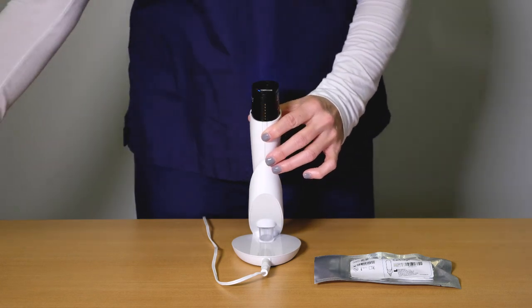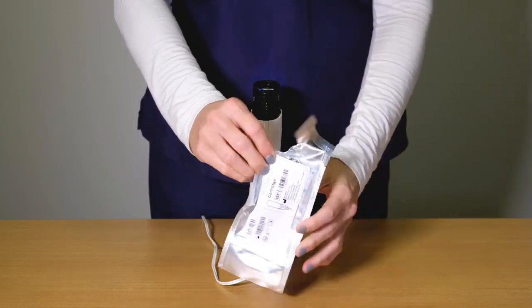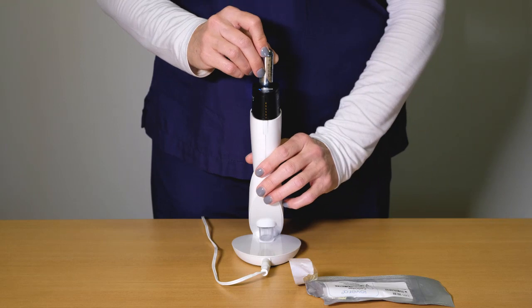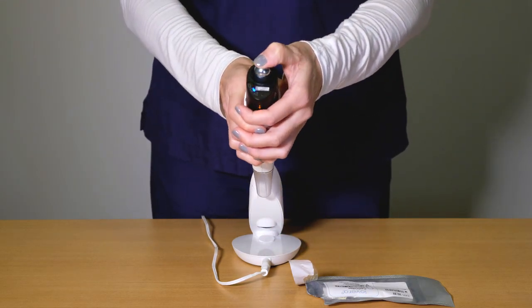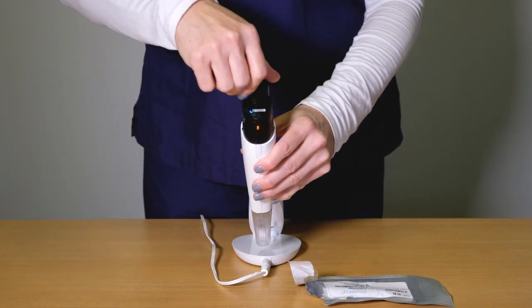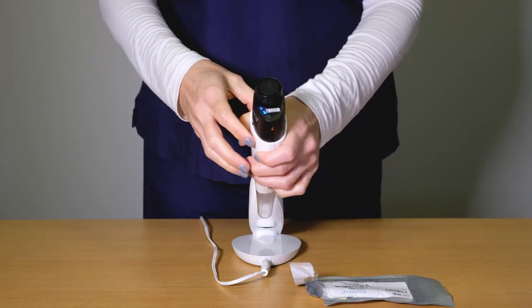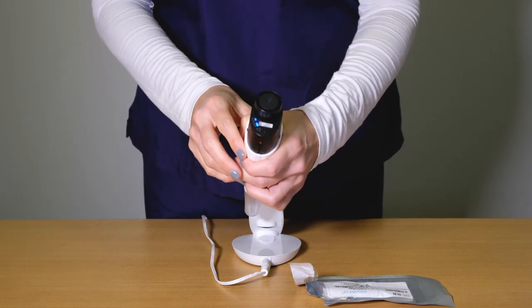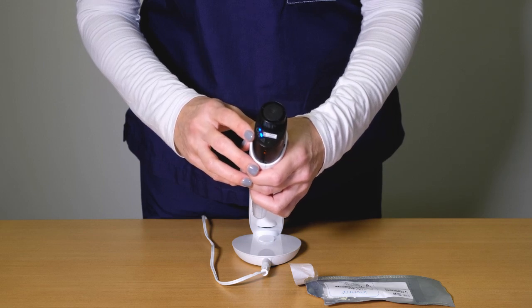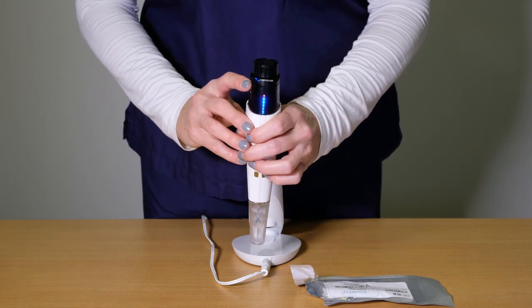Remove the spent nitrous oxide cartridge. Remove the new nitrous oxide cartridge from its pouch and insert until you feel a click. Tighten the cartridge cap clockwise until the cartridge status LED pulses blue. When both the cartridge and smart tip status LEDs are solid blue, the handpiece is ready to begin a treatment.